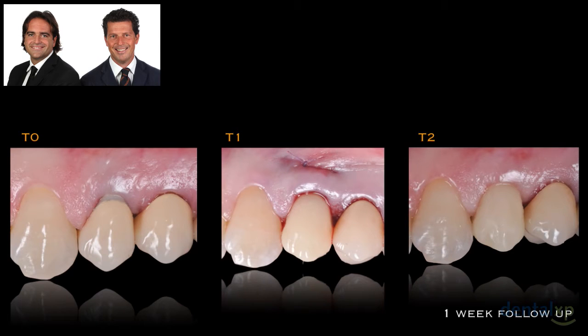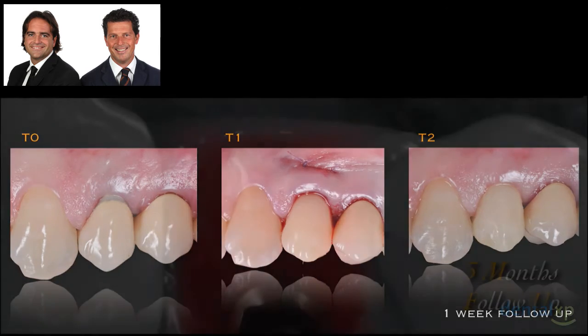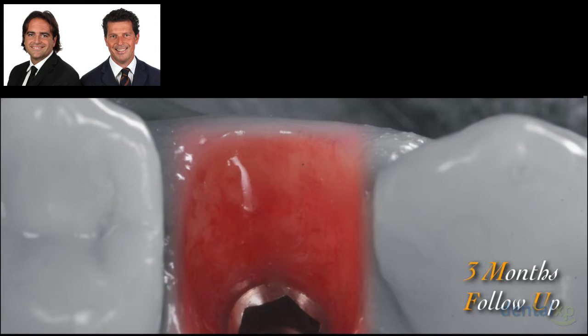compared to T1, which is exactly the same day but after the surgery, after the overbuilding of the site, and at T2, which is at 1 week follow-up, you can see how the tissue is creeping onto our provisional, how the tissue is adhering, how everything is blending together for our final provisional restoration.